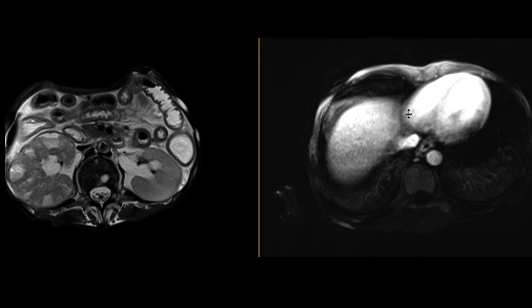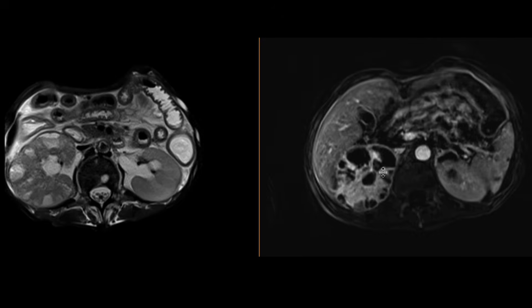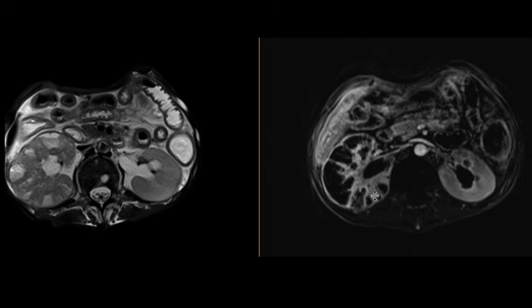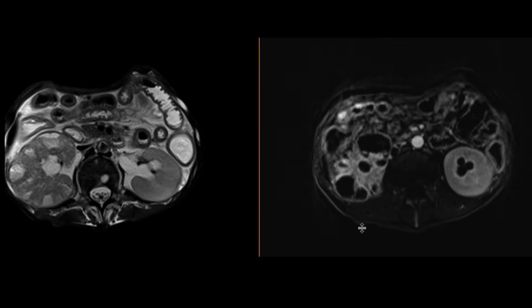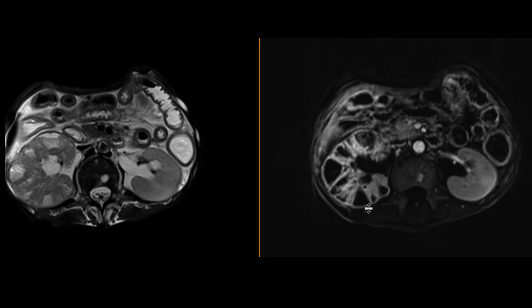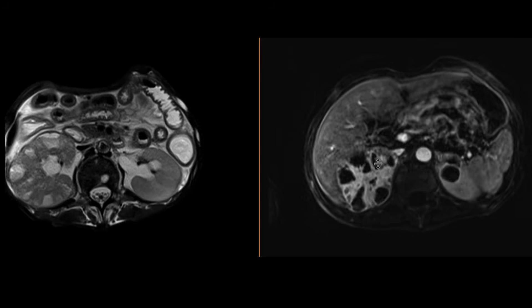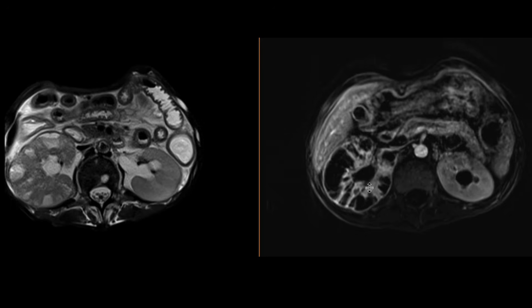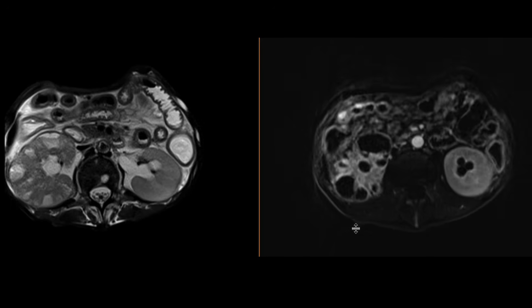On the post-contrast sequences, there is no enhancement within these collections, and the surrounding areas demonstrate thick rim and septal enhancement. Overall, this is highly concerning for really extensive pyelonephritis with abscess formation.